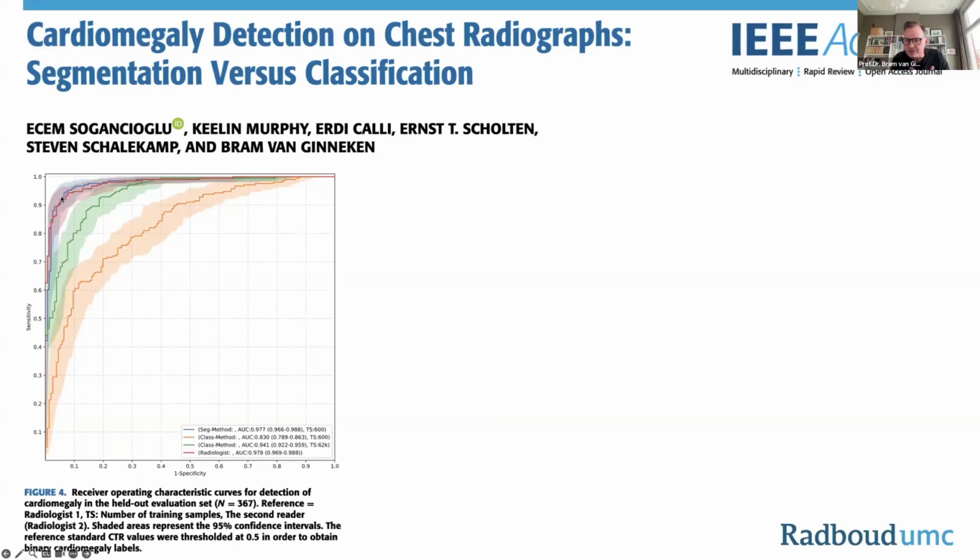Now, why do radiologists not have a perfect result? Well, the cardiothoracic ratio, which defines cardiomegaly, you will always have borderline cases, right? The threshold is 0.5. So if you have a case which is just borderline cardiomegaly, one person will measure a little bit longer line than the other person. So you will always have inter-observer variability. But it's actually possible to do this with over 90%.